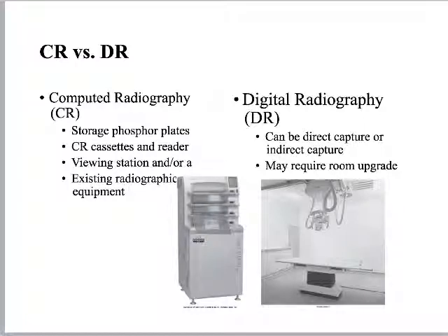It's able to use the existing X-ray systems. Thank you. So like in our lab here in the school, I think y'all have all had a chance to take an X-ray at this point. We used a CR system to take that X-ray. It didn't require any fancy new equipment. In fact, the one room that we use, the smaller X-ray room, still has a 3-phase 6-pulse X-ray generator. It's old school, but can it take a CR image? Yeah, it can. So it's readily adaptable to old school conventional radiography, right?